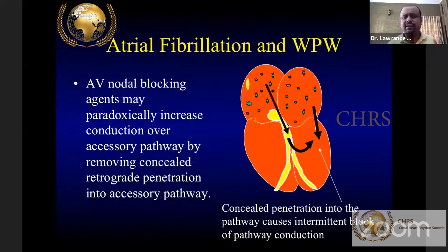One thing you should be very careful about, for the sake of understanding, I'm telling you, whenever you see atrial fibrillation in a pre-excitation syndrome. Although this is not part of narrow QRS tachycardia, most commonly what you see is a wide QRS tachycardia because the tachycardia goes through the pathway. When you have atrial fibrillation, it goes to the accessory pathway and produces a wide looking irregular tachycardia.